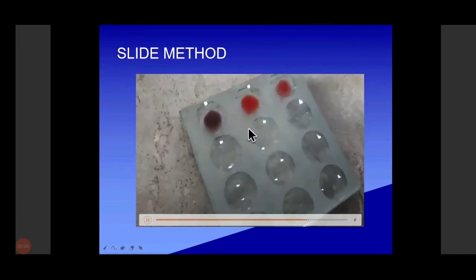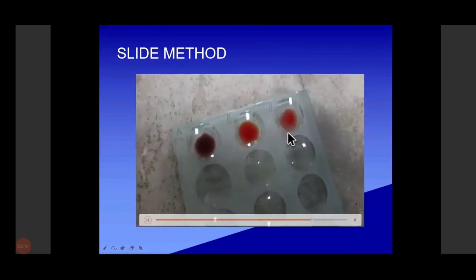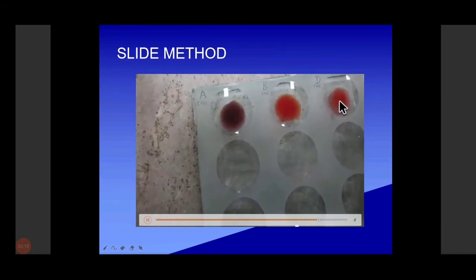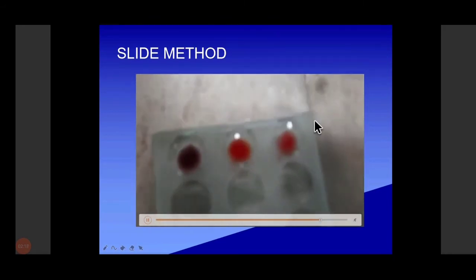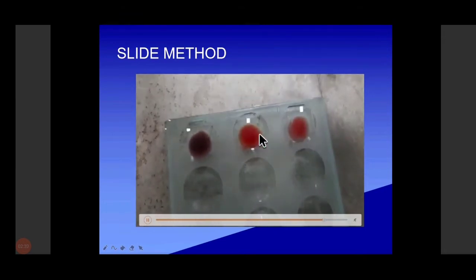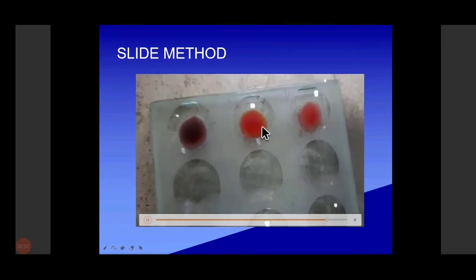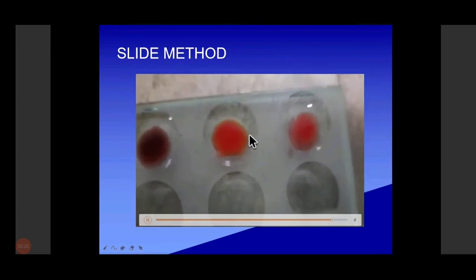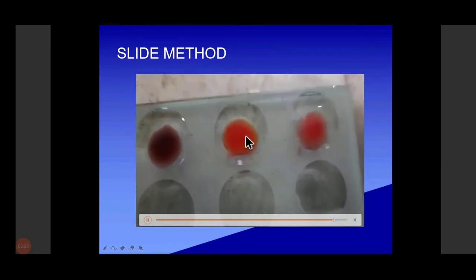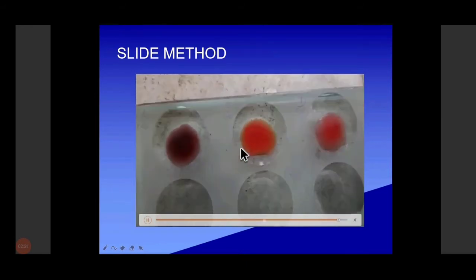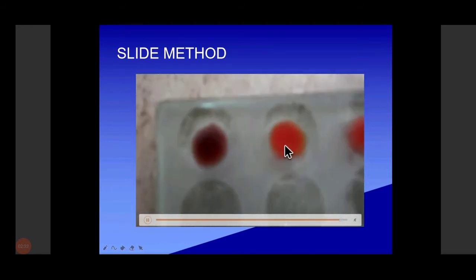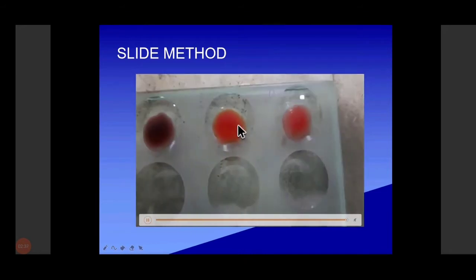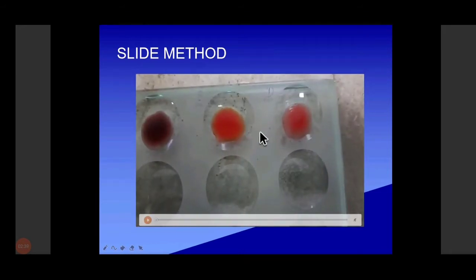Now you can see agglutination — dot, dot, dot here. In the D column, there is a presence of D antigen, that is Rh positive — you can see some dot agglutination here. Here there is no agglutination. You can see small microdots in the periphery. So it is B positive.